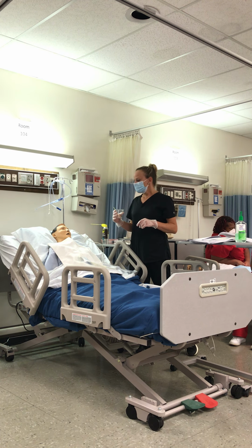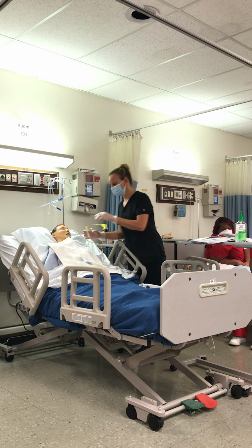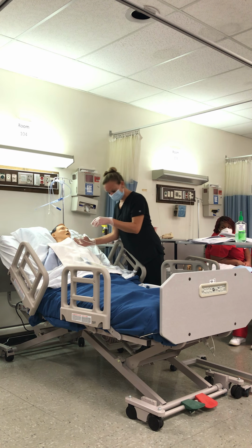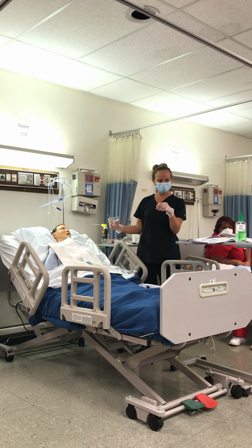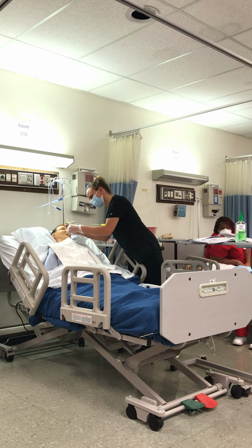Okay. All right, now they're freaking out, okay? Because we have just literally put a tube down into the respiratory tract. So we're gonna try it again though, we gotta get this tube in. So swallow, where's his head? Down. Does it stay down the whole time? Don't have to. Just until we feel like we've made it down in towards this direction. Does that make sense? Alright, so swallow, he's swallowing 3 to 5 inches. Alright, we're not having any problems. That seems like a long way, doesn't it? Yeah. Alright, he says he's good. And that's as far as it will go.